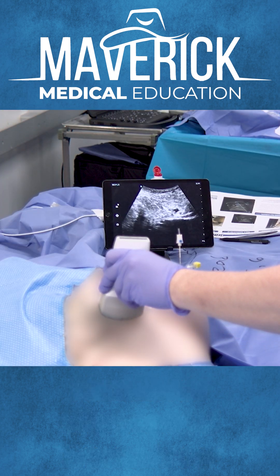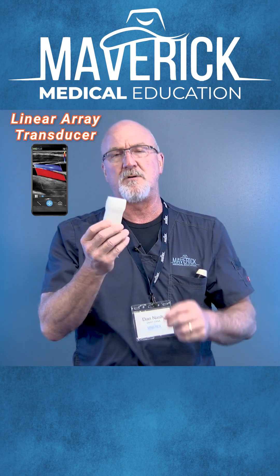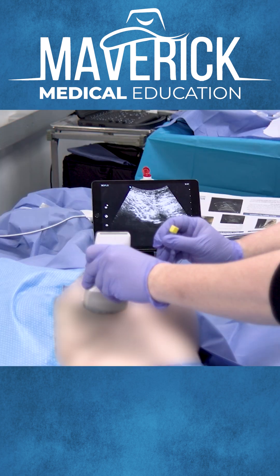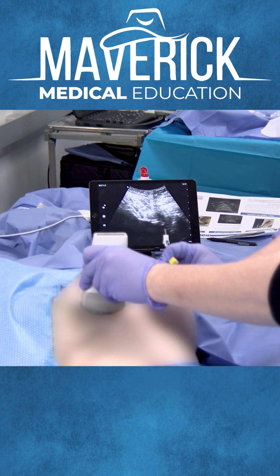This probe is two probes in one. We have a linear side, which is a high frequency side for doing shallower, more highly defined blocks, and then a curvilinear side, which is a low frequency side. You get a little bit less definition, but you can see deeper with blocks for abdominal things.